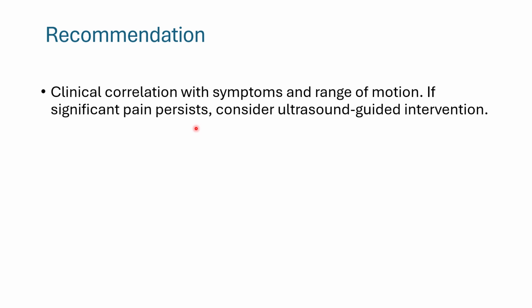When a calcification is causing inflammation in a tendon, that's why you call it calcific tendinitis, because the calcification is the one that is causing inflammation of the tendon. That's how the two are joined. It doesn't necessarily mean that if you see a calcification in a tendon, it's causing inflammation. It can be there without causing inflammation.